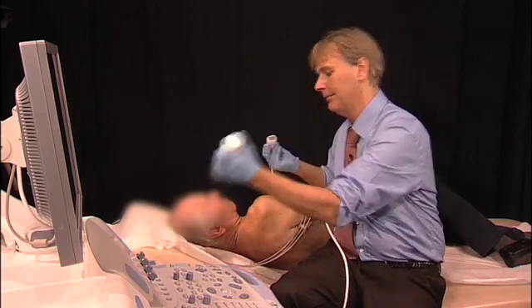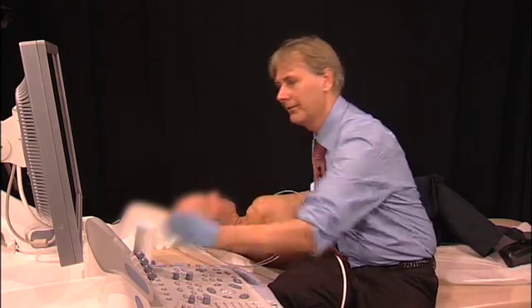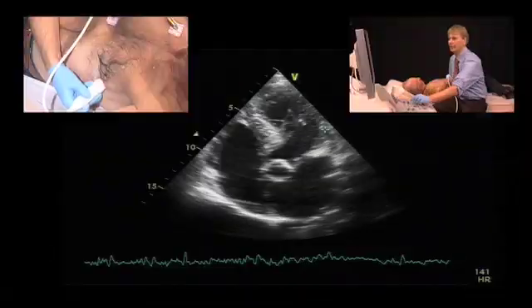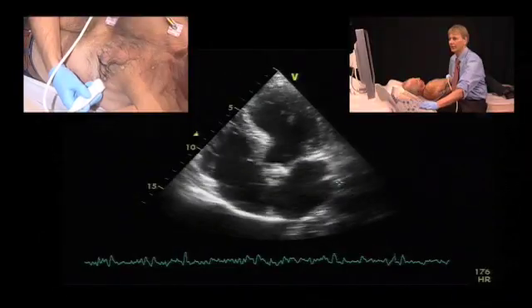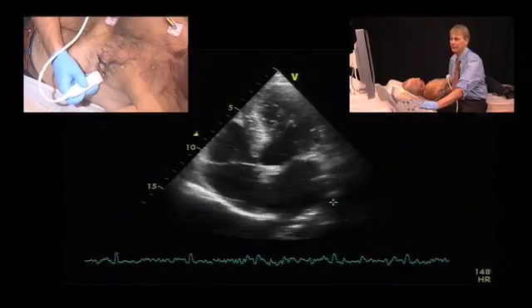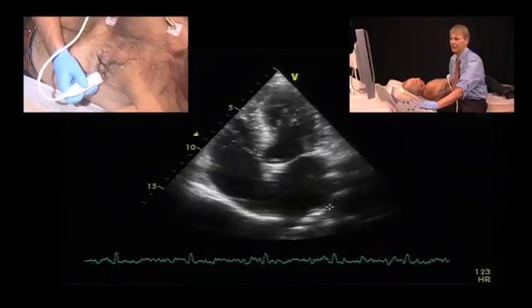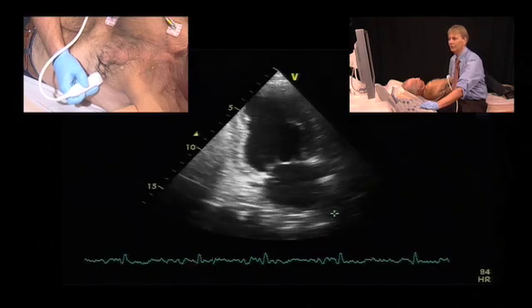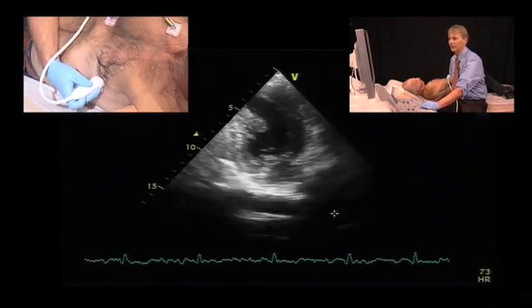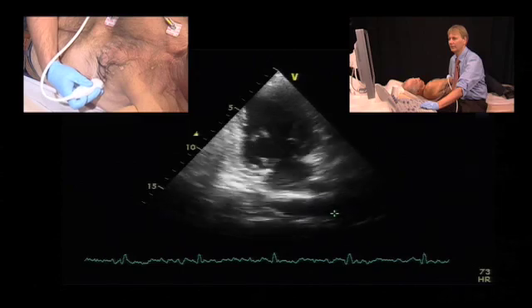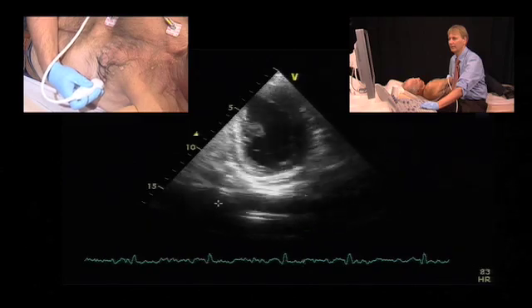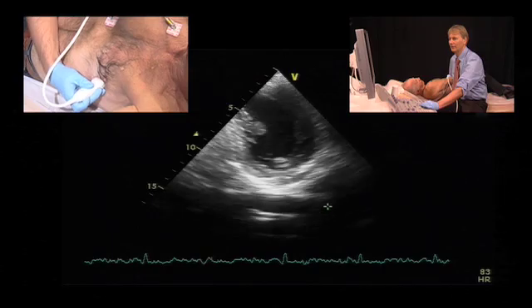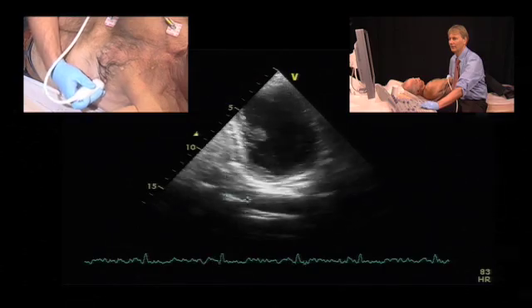Moving to the apical view, we have the aorta right beside the left atrium. If we go to a two-chamber view and tilt the transducer, the descending aorta is also visible here very nicely.